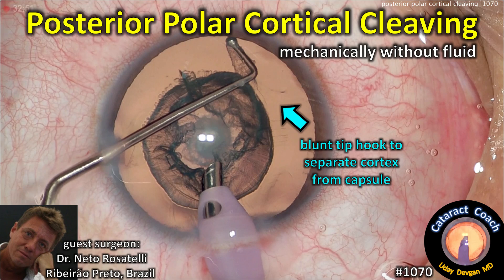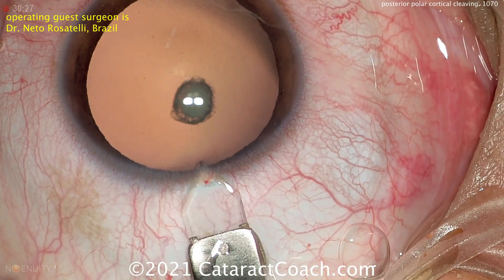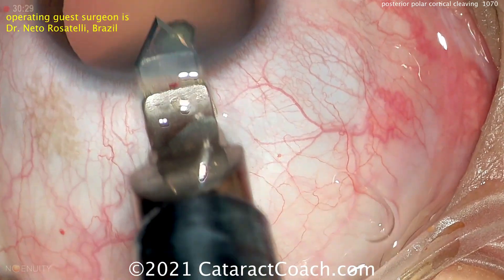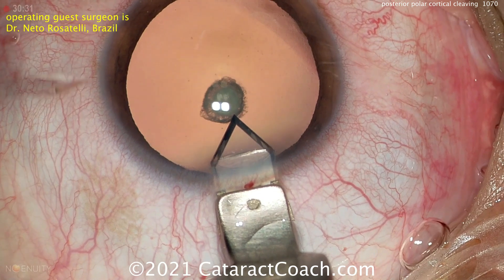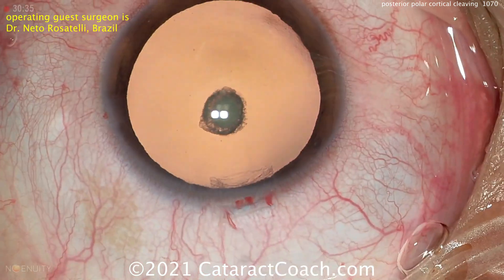CataractCoach.com — Posterior Polar Cortical Cleaving. This is mechanical without fluid. Our guest surgeon is Dr. Neto Rosatelli from Brazil. Dr. Rosatelli is one of my favorite surgeons to watch. He is so incredibly talented. Now look at the video here.